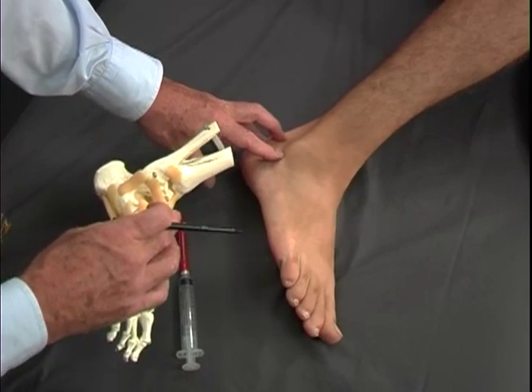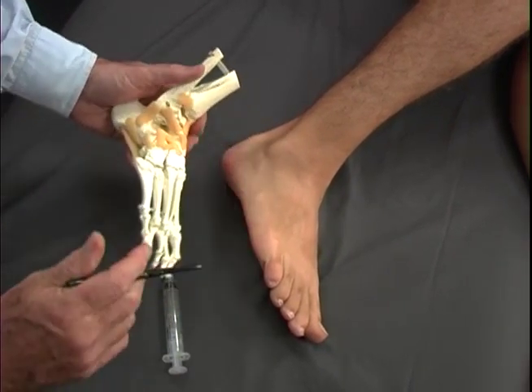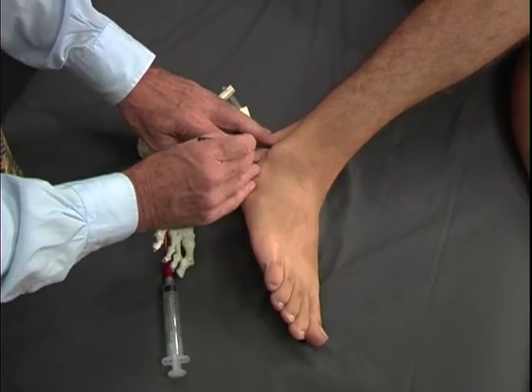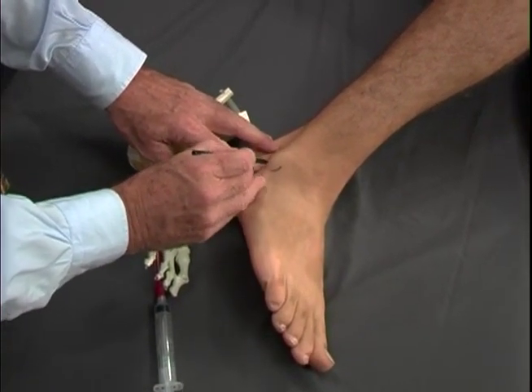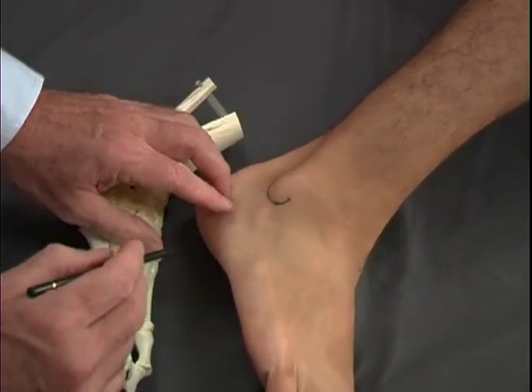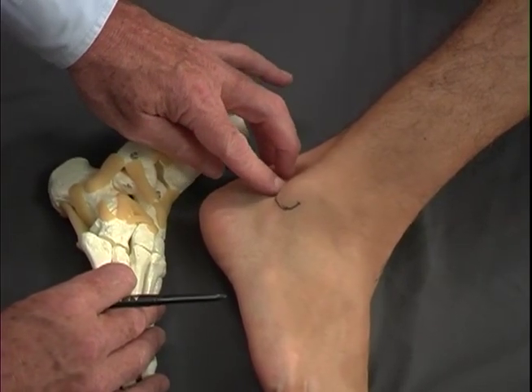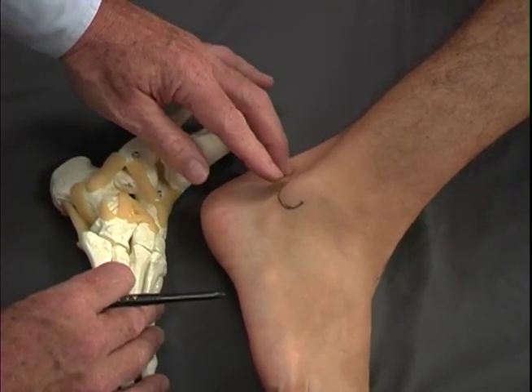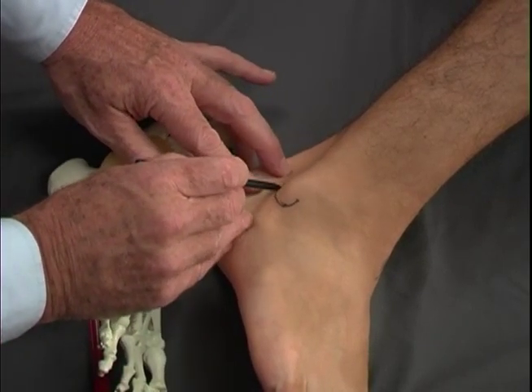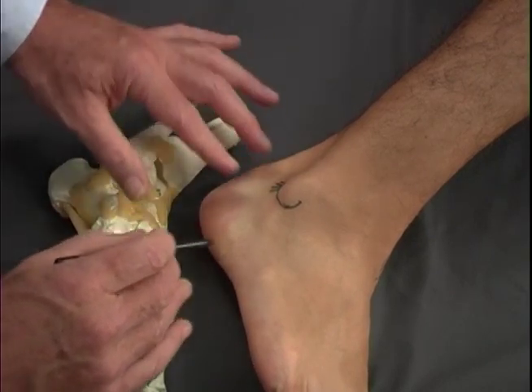We're now looking at the lateral part of the ankle, and again carefully drawing our anatomy with the lateral malleolus, the bottom of the fibula, the lateral ligaments, the posterior talofibular ligament coming right here, and we can feel the little bump on the talus coming over to the fibula.